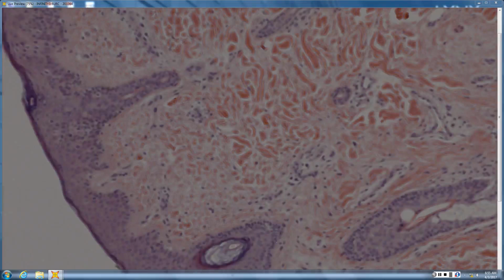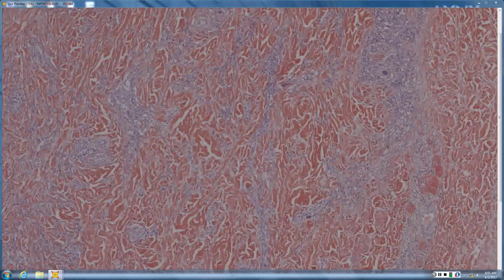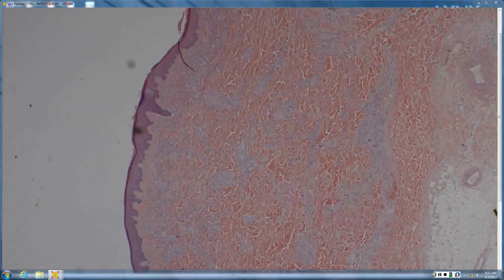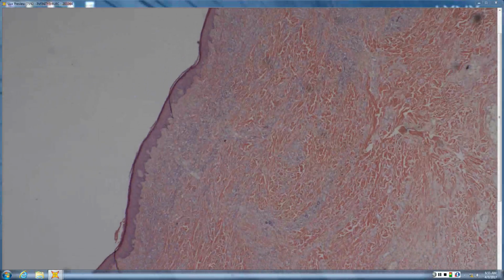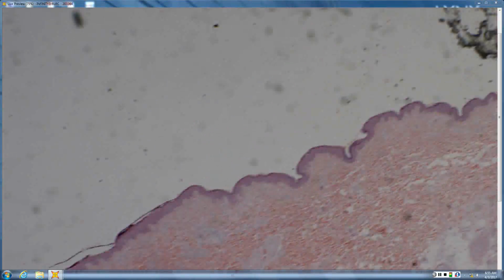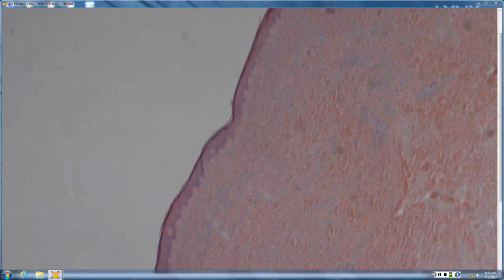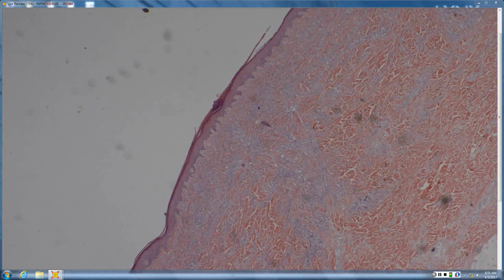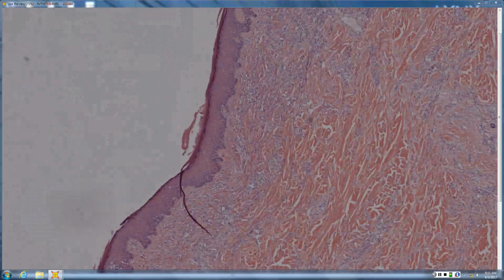Okay, and then that's what it makes me go. Number 3 is going back to the patch stage of Kaposi's. And so here, you can see why this would be, or why this is challenging. From scan, it can almost be hard to even see that there's much going on. Your eyes will then start to pick up on these little vascular proliferations, but they're pretty subtle. This is a pretty big lesion, though, but if it's a very small lesion, it can be very difficult.